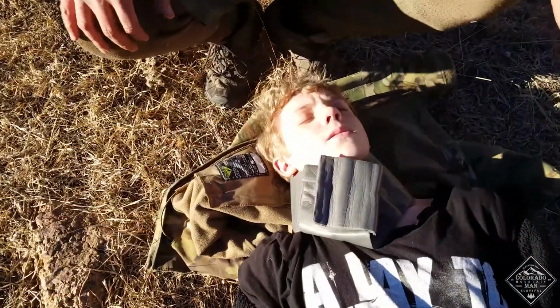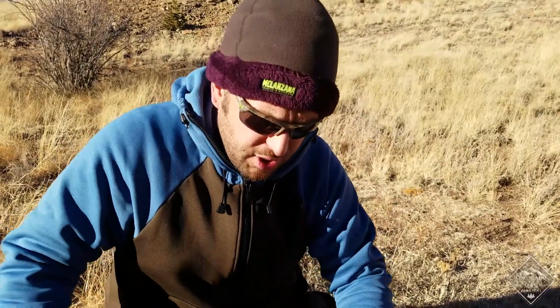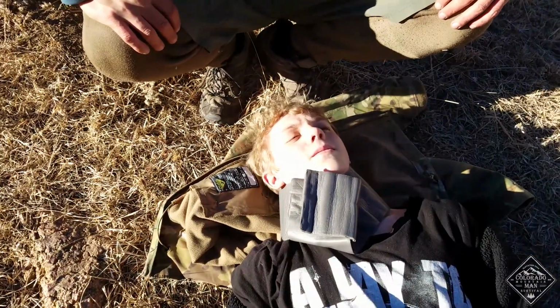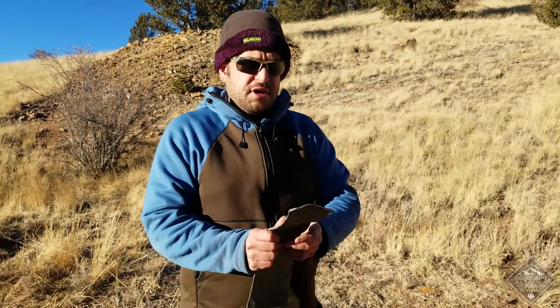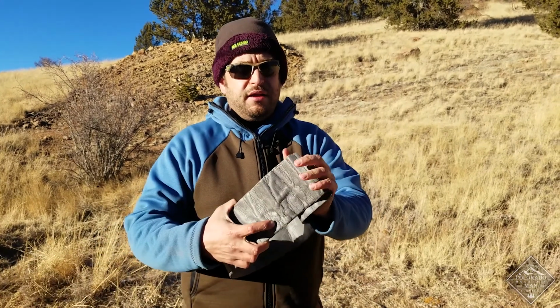You can always reassess this when you're done. You do this, do a rapid assessment. When you're done, come back and tighten this up, make it look a little bit better, pad it, whatever you want to do. But for right now, move your head a little bit, see if you can wiggle it. So it's pretty secure. This is one of probably my favorite methods right here. So cool. So that's two ways to use the SAM splint to immobilize somebody's cervical spine.